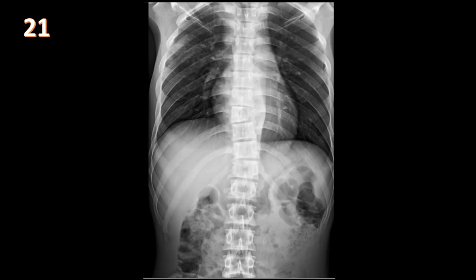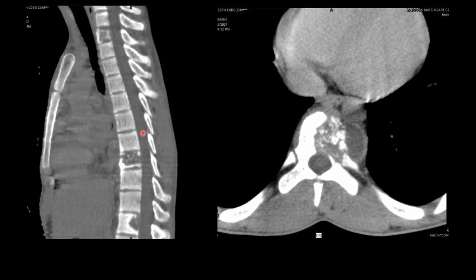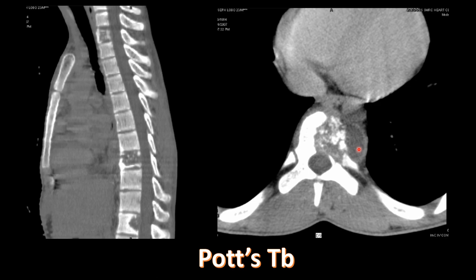AP view of the thoracic spine shows focal scoliosis at T9 with vertebral body destruction, initially suspected to be metastasis. CT with sagittal reconstruction reveals destruction at multiple thoracic levels with a rim-enhancing fluid collection at the anterior paraspinal spaces — classic for Pott's disease, tuberculous infection of the intervertebral disc and endplates (tuberculous spondylodiscitis). Pott's disease can affect multiple levels with skip lesions and characteristically extends through the anterior paraspinal spaces.